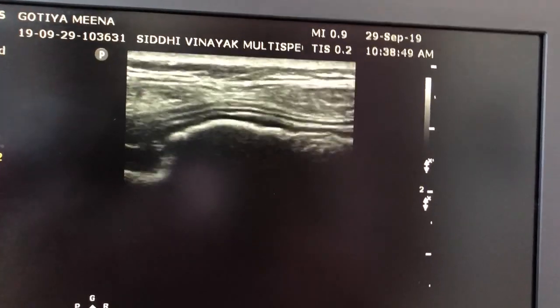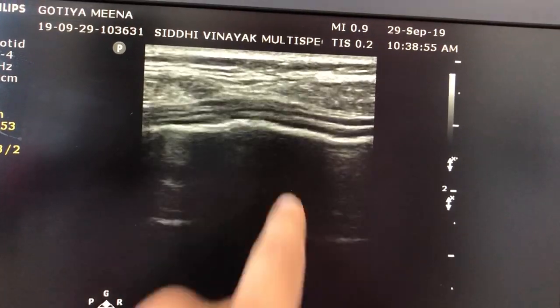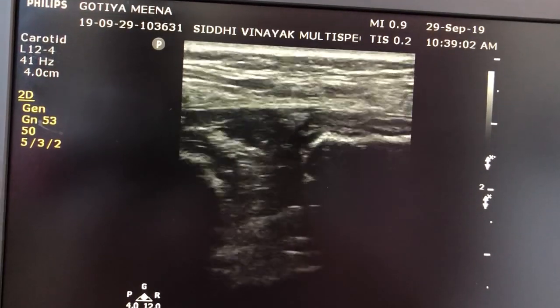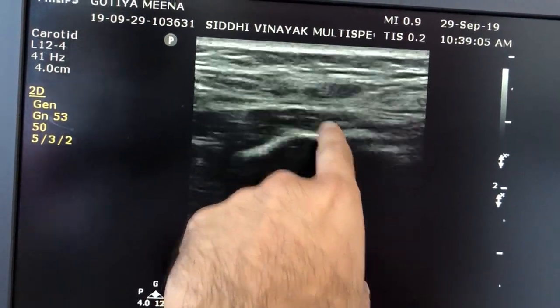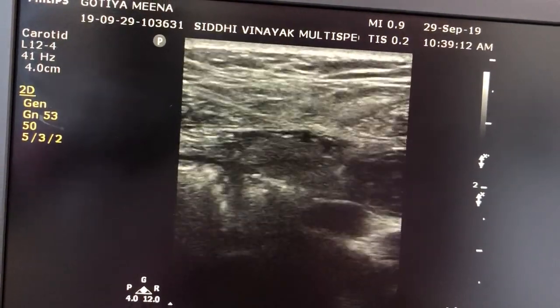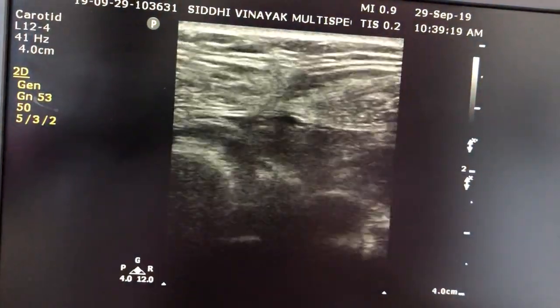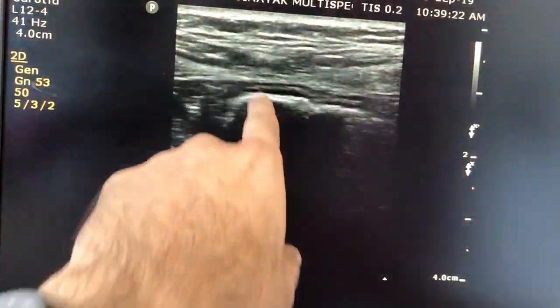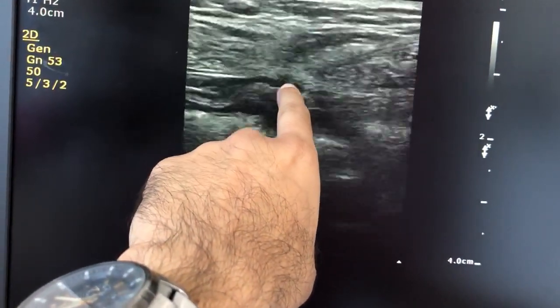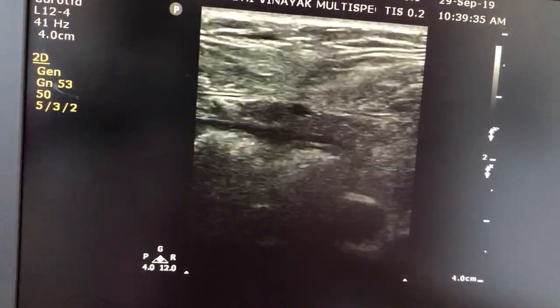transversely, and now we will go slowly, step by step, downward inferiorly, keeping this linea alba in transverse view. You see that this is the rectus muscle, this is linea alba. If you go inferiorly, now this is another rectus muscle. This is the right side rectus muscle. Here this is linea alba, and if we go inferiorly, this linea alba is a little bit hazy and not clearly seen between the two rectus muscles.